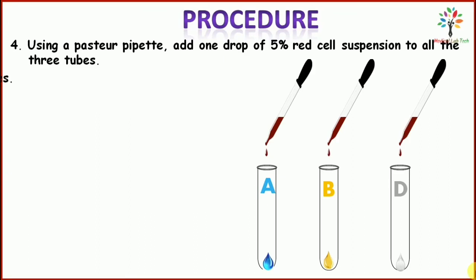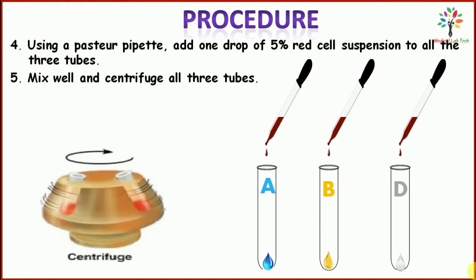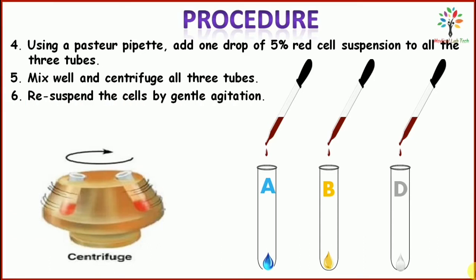Mix well and centrifuge all 3 tubes at 1500 rpm for at least 1 minute. During centrifugation, the rate of antigen-antibody interaction will increase. Remember to balance the tubes prior to centrifugation. Then resuspend the cells by gentle agitation and observe for agglutination.